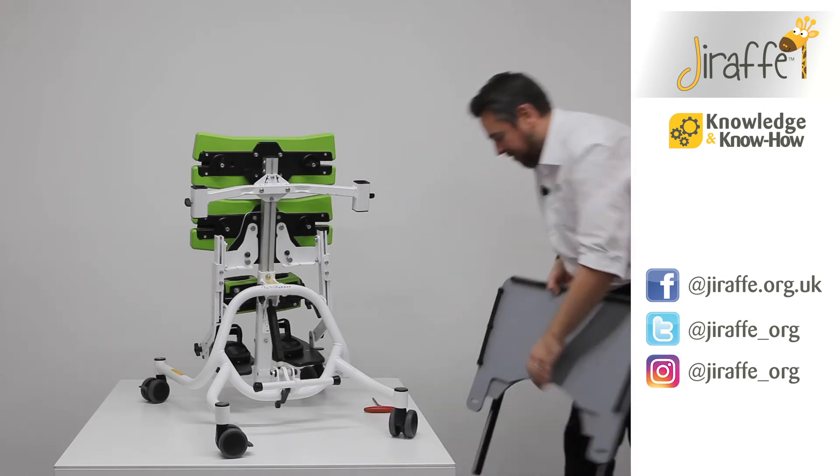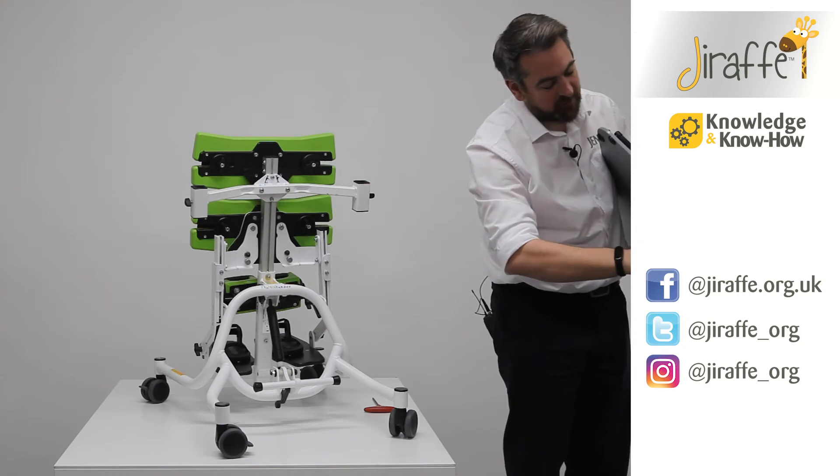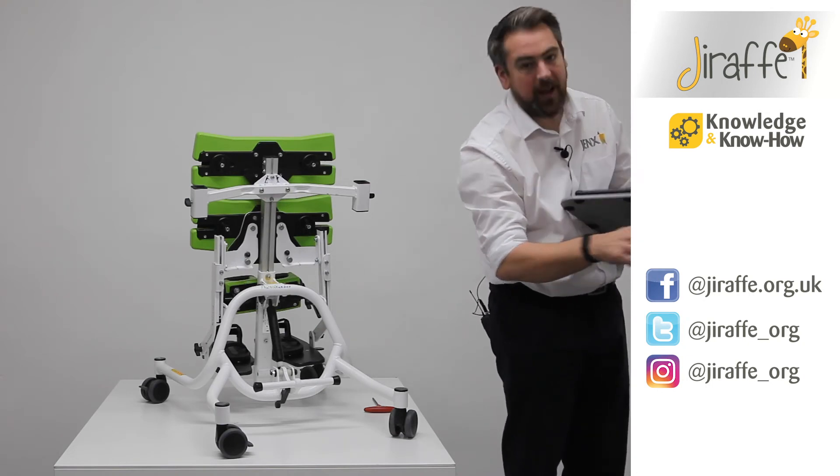Then we return to our tray and change the orientation of our tray support arms so they're now in a downward direction.